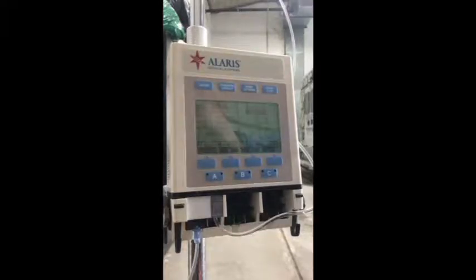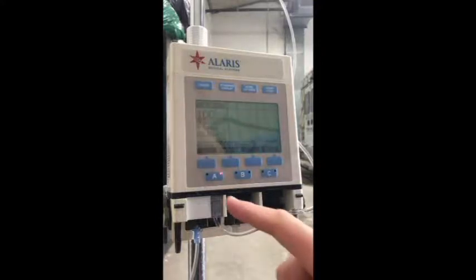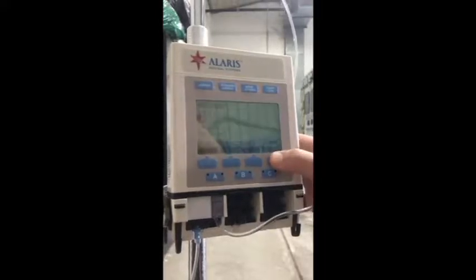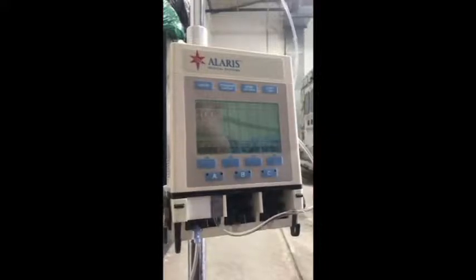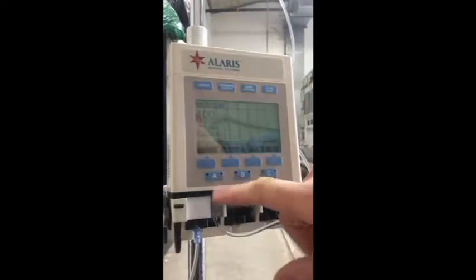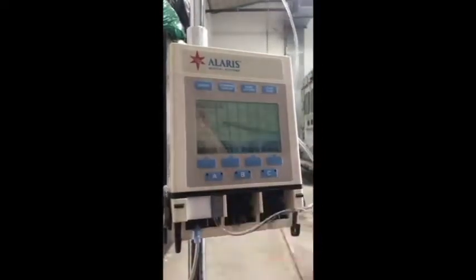We are infusing into the patient. Everything is going along. Now we have an error. The light indicates that we have an error. First thing you always do is hit the quiet button. That way it silences it from beeping at you. Then you press the channel, you can see alarm. And so we will press that channel.